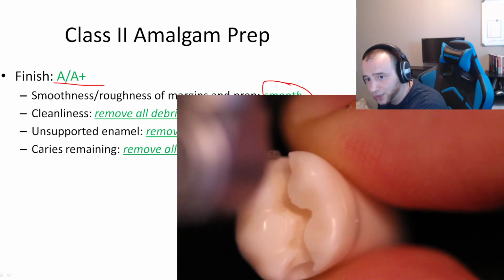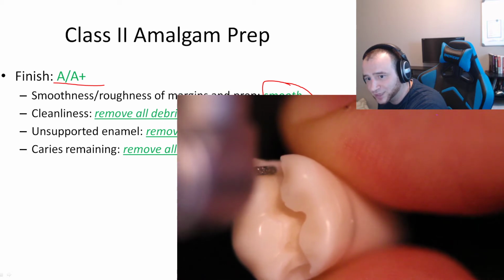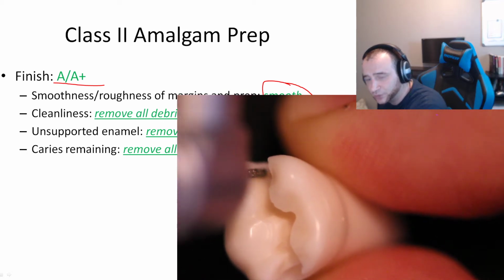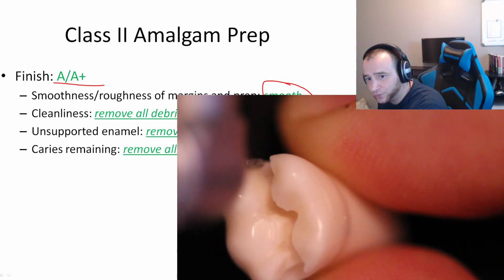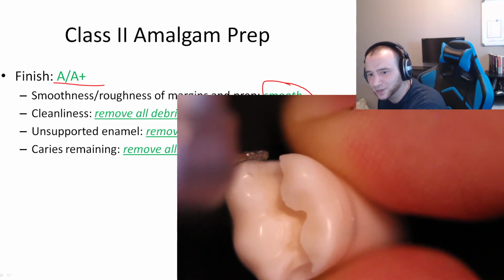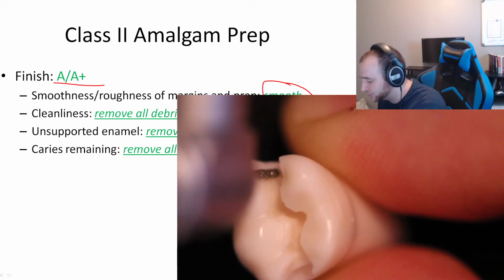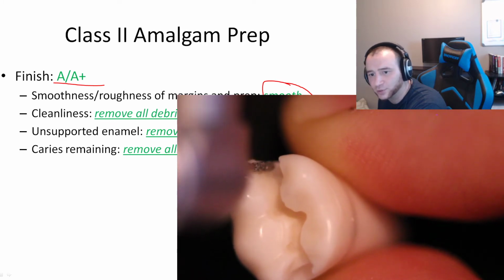See how I'm going the entire wall, and I start off from the inside, near the axial pulpal, and then I move like this, and I keep doing that until there's no bump anymore. There's no acute angle there anymore. Okay, so I might be light here, and then just make sure that bump is gone. That way I make sure my wall is still straight, converging, and my angle is defined. My line angles are defined, and I remove my unsupported enamel.